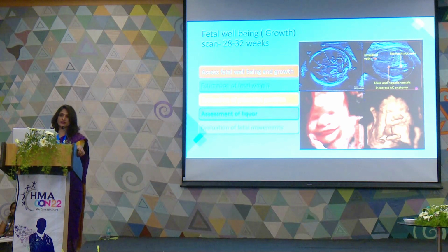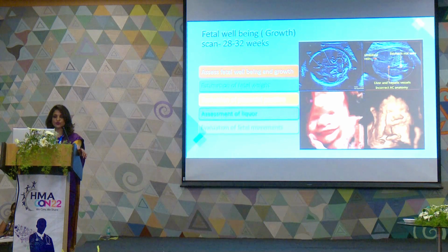Fetal well-being scan is done at 28 to 32 weeks to assess fetal well-being, growth, estimation of fetal weight, evaluation of placenta, liquor, and fetal movements. We can do very well a 4D scan at this stage.